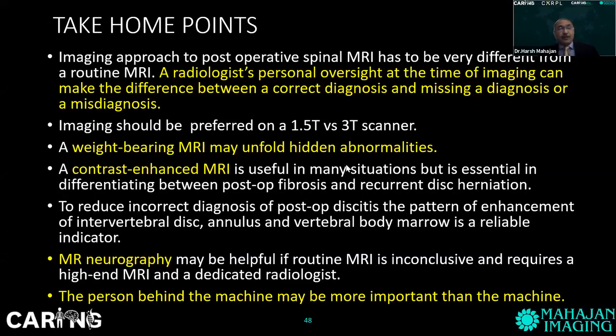In conclusion, I'd like to say the imaging approach to post-operative spinal MRI has to be very different from a routine MRI. A radiologist's personal oversight at the time of imaging can make the difference between a correct diagnosis and missing a diagnosis or a misdiagnosis. 1.5 Tesla to be preferred over 3 Tesla. A weight-bearing MRI may unfold hidden abnormalities. A contrast-enhanced MRI is very useful.